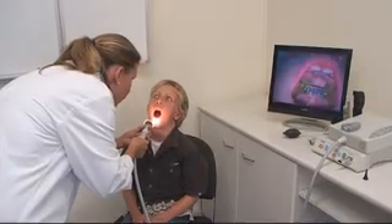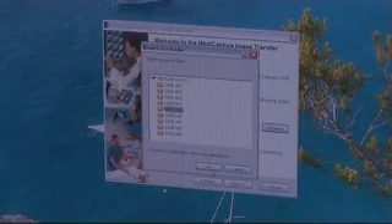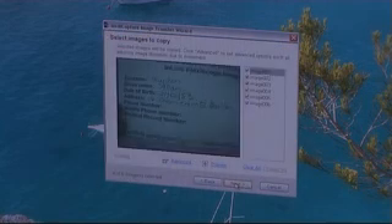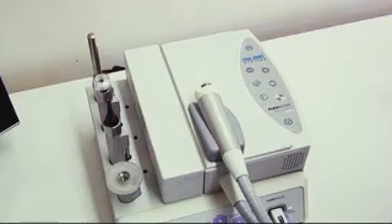The contents of the internal memory is then deleted and a new patient can be examined. Images from this new patient will be stored in a separate directory on the USB stick, making the download process onto a PC simple. Typical image sizes are around 100KB, allowing approximately 5000 images to be stored on a 512MB USB stick.